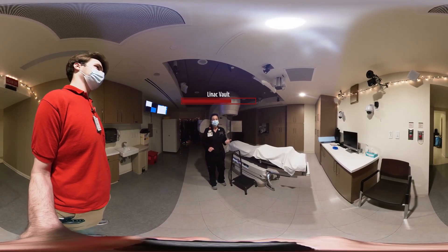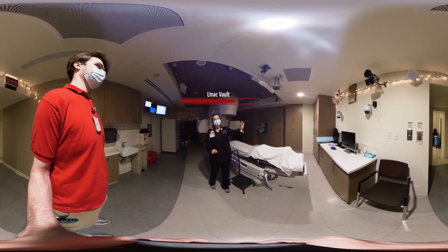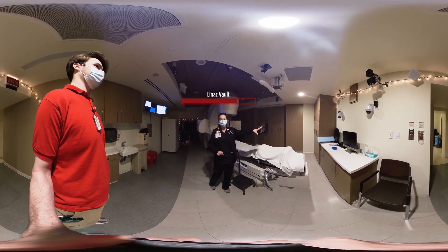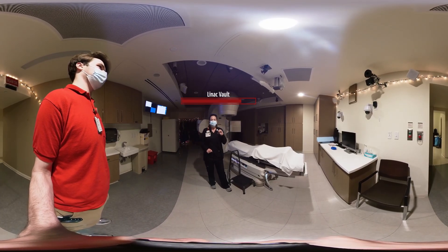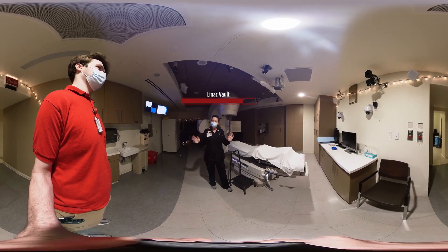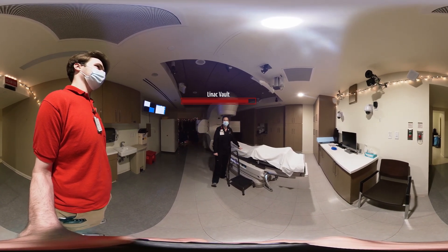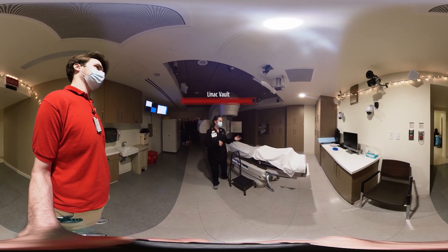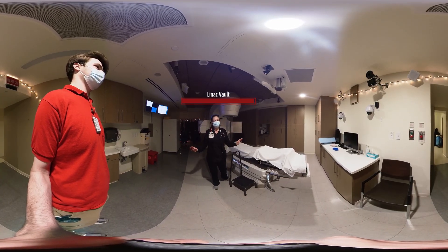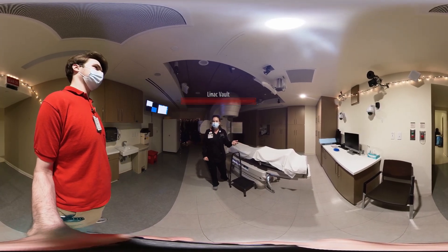Once the doctor reviews all your images, we're going to go ahead and get started with treatment. Just remember, we can see you at all times — there are camera and intercom systems. If you need us to come in, just go ahead and holler out nice and loud, or wave your hands and we'll come in. While you're laying on the table, the most important thing is just try to relax and breathe normally. This whole process should take about 15 to 20 minutes. Do you have any questions before we step outside?